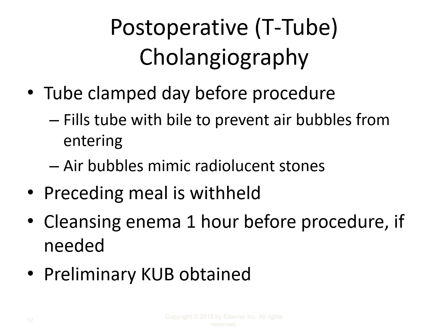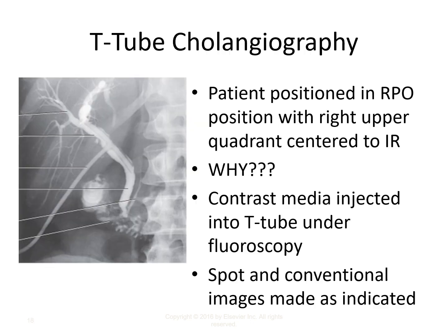That's what an RPO position does, it separates the gallbladder and the biliary system from the midline and puts it squarely in the right upper quadrant of the abdomen, well away from the spinous structures. So check with your radiologist to see if they want more than just a KUB for the scout film. They might want that non-contrast RPO for comparison as well.